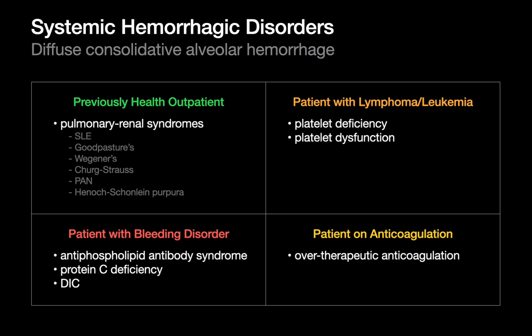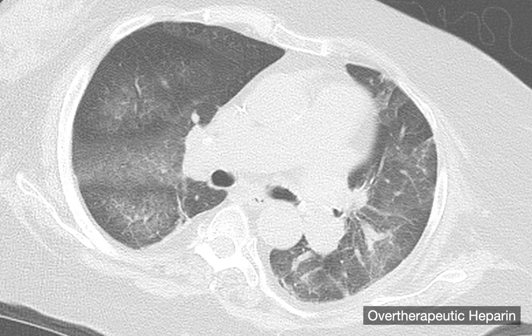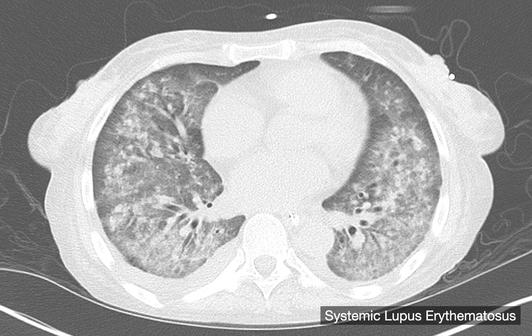If entertaining a systemic hemorrhagic disorder presenting as diffuse alveolar hemorrhage, categorize the patient into one of four groups: if previously healthy, think pulmonary-renal syndrome; if the patient has lymphoma or leukemia, think platelet issues; if there's a bleeding disorder, consider that; and if the patient is anticoagulated, consider over-therapeutic anticoagulation. Here's an example of diffuse hemorrhage — this case is more ground glass, representing a moderately severe case where the airspace opacities are slightly denser.